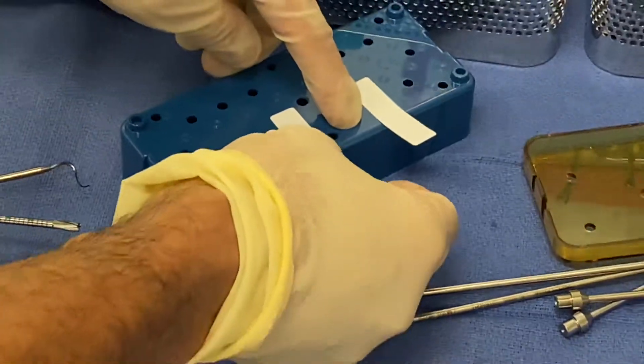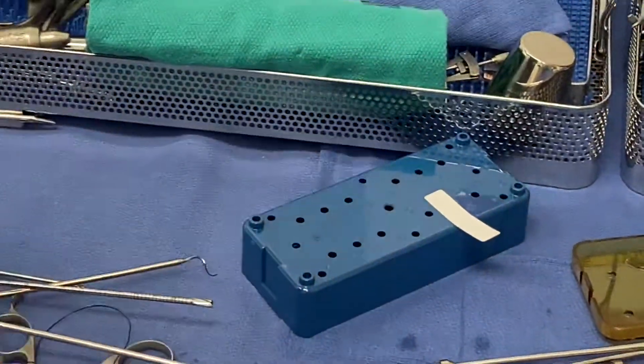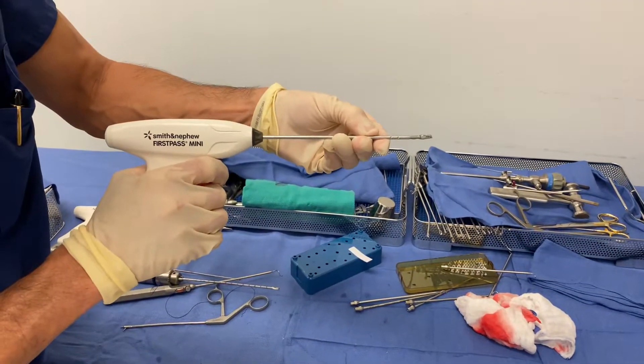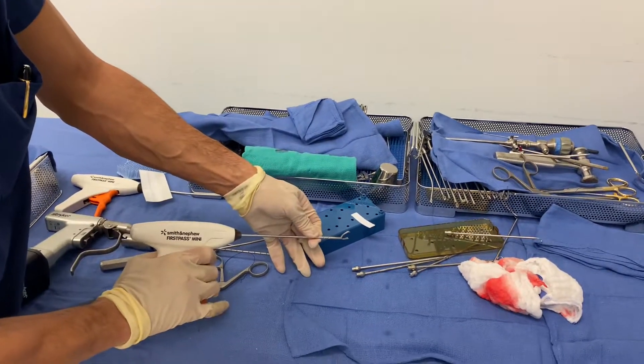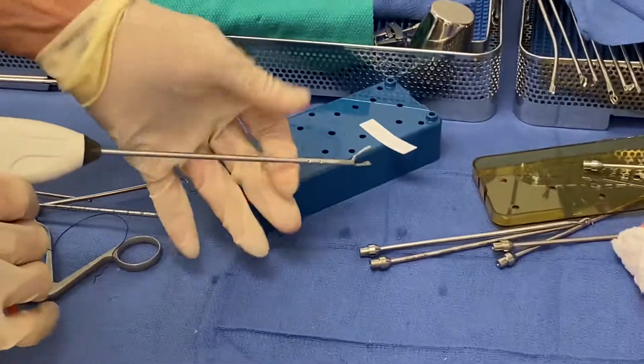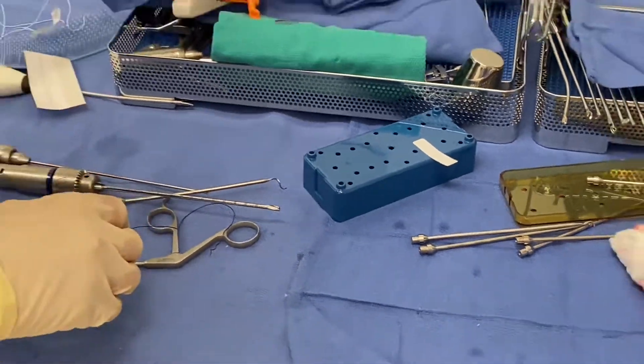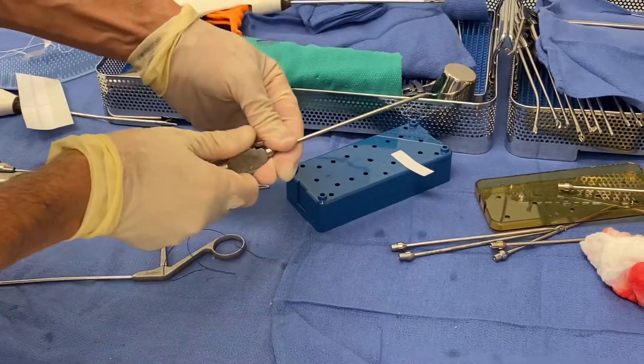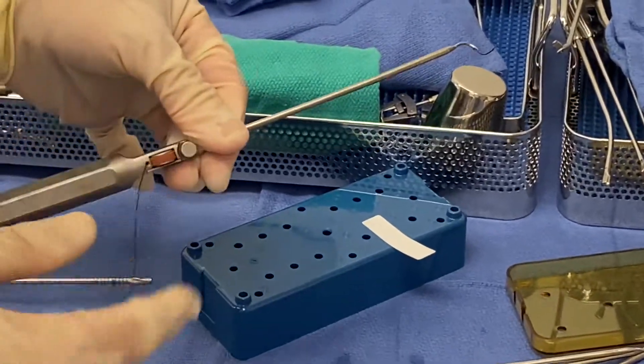But sometimes because of the anatomy, you just cannot open the jaw in the knee. And then you have to have a backup plan. My backup plan is a spectrum type passer — a pigtail type passer that's hollow.